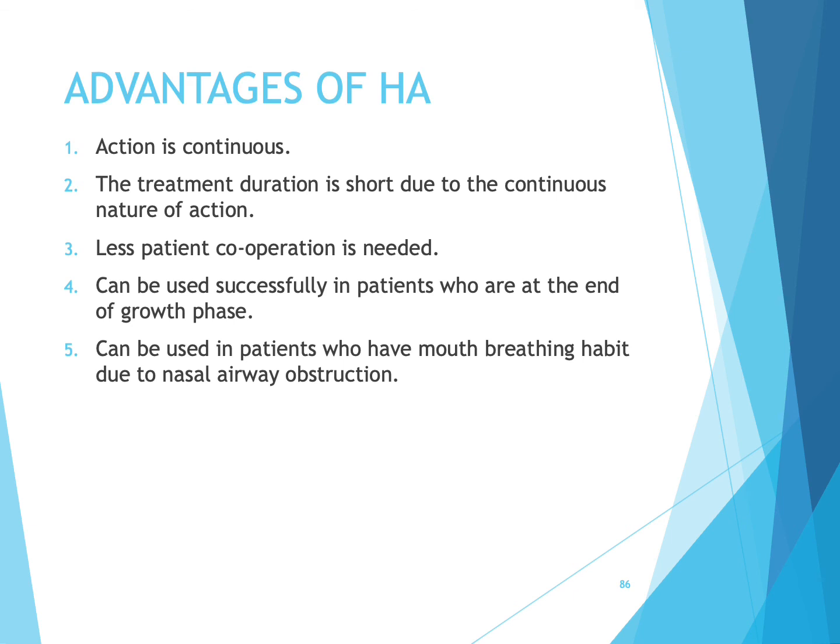The following are advantages of Herbst appliance. The action is continuous because it is a fixed functional appliance and is cemented to the teeth. The treatment duration is short due to the continuous nature of action. Less patient cooperation is needed. It can be used successfully in patients who are at the end of growth phase and can be used in patients who have mouth breathing habit due to nasal airway obstruction.